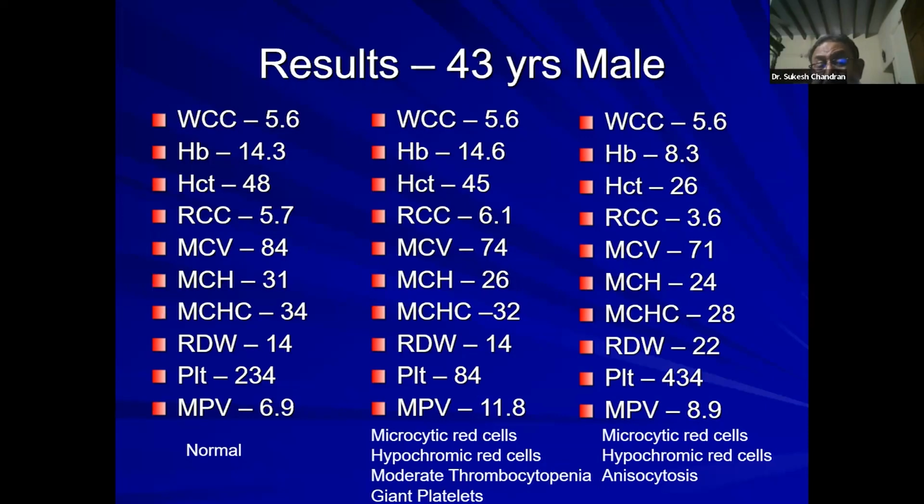But what I do is I allow this definitive flag information to go to the LIS, where the pediatrician and the physicians look at the results. And when they see microcytic red cell, they will want to know what the MCV is. So they'll call me, what is the MCV, Sukesh? I'll say that if you ask the patient to pay for MCV, it automatically comes on the record of the patient. So using this information, I can actually make some money for my hospital.